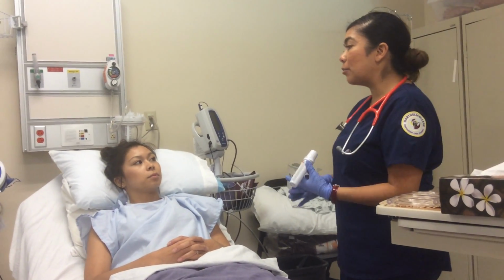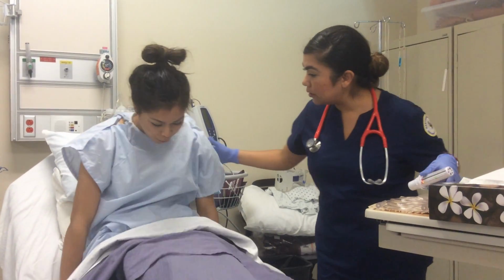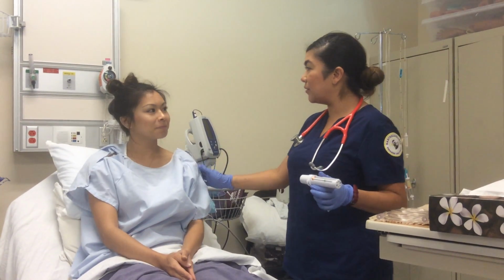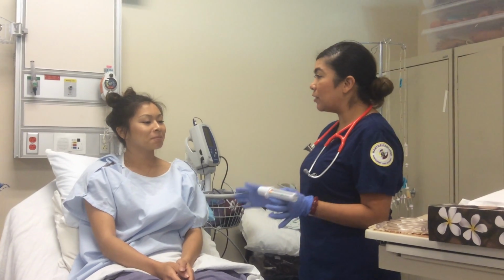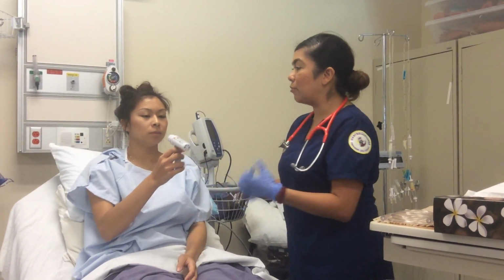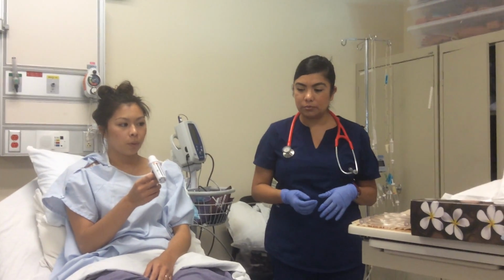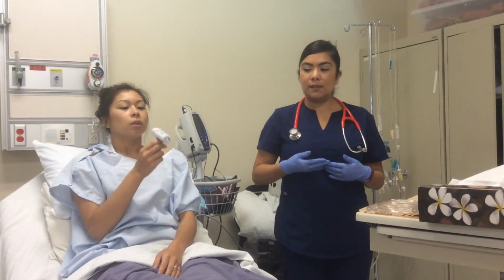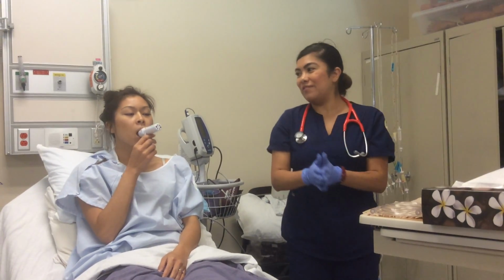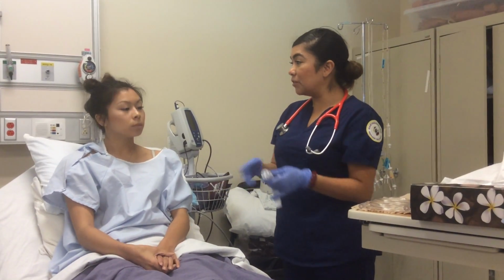Okay, now for this, I am going to ask if you could sit up. Is it okay if you could sit up? Okay, do you need help? No. You're okay? Okay. You feel okay? Okay, perfect. Do you have any questions so far? No. No? Okay, you could just go ahead. And remember, I'm going to walk you through it. So I want you to exhale out. In. And then, blow. Very good. Good job. So, okay, I got 350 for the first one.